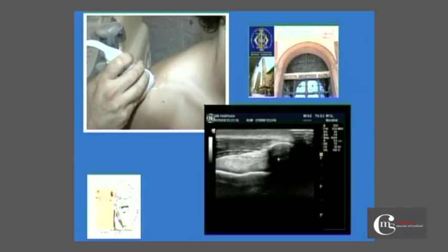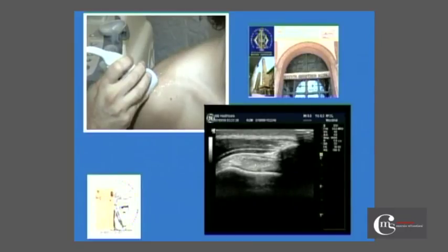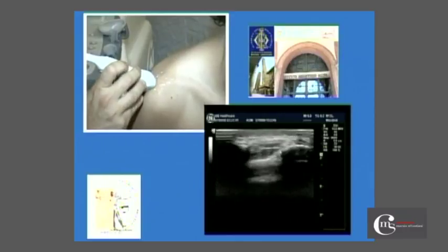We then move distally. As we move distally, we see the end of the acromion and the beginning of the rotator cuff. Here we see the supraspinatus tendon with its insertion on the anterior facet of the greater tuberosity. It is separated from the deltoid by the subdeltoid bursa.